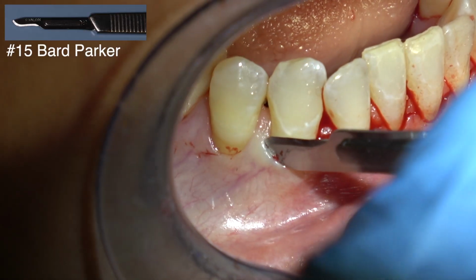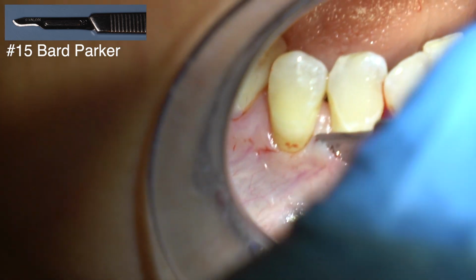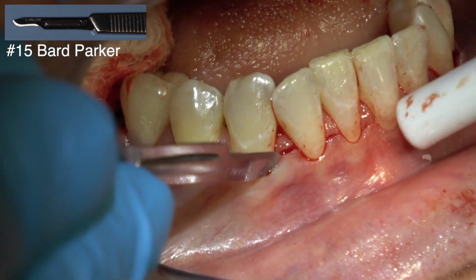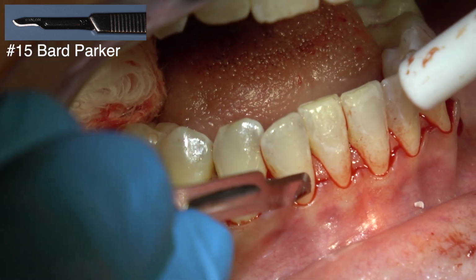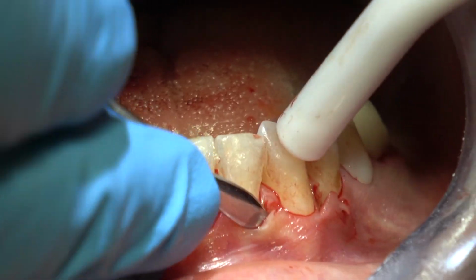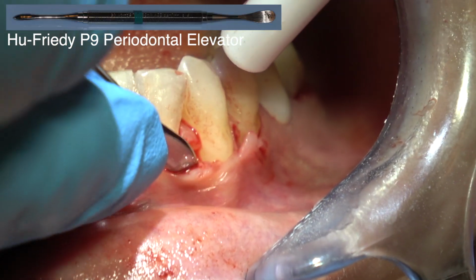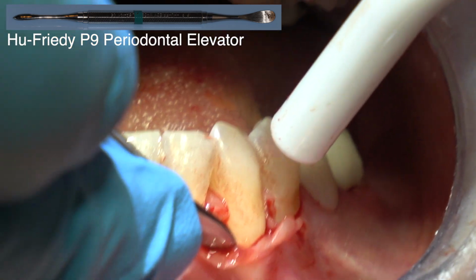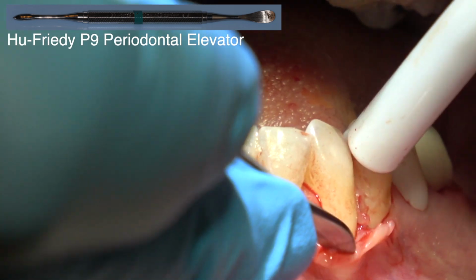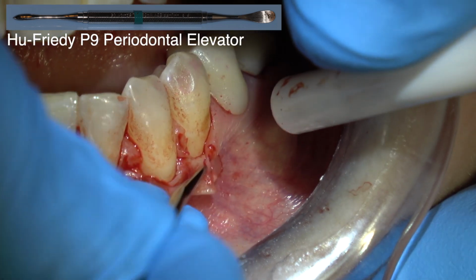This will cut in to the papilla this way, leaving the papilla, but you're going to remove the facial half. Just be very careful. It's like working with toilet paper. It's so thin, so keep no big movements. Keep the periosteal elevator on the bone and just peel it away. It's hard to reflect this tissue.